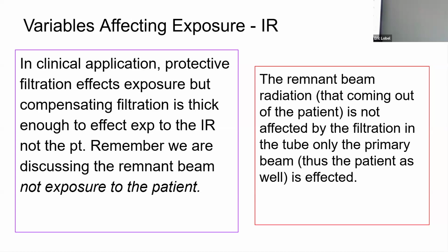What's the recommended filtration on our normal rooms that operate around 70 kV? No, it's the number you're never supposed to forget. 2.5, thank you. The last class, everyone said 2.5 simultaneously. I think the caffeine was really peaking in the last class. And you guys have kind of slowed down maybe just a little. Even people in my MRI classes that are out of X-ray school for like 10 years still remember 2.5. It's like hammered into them.